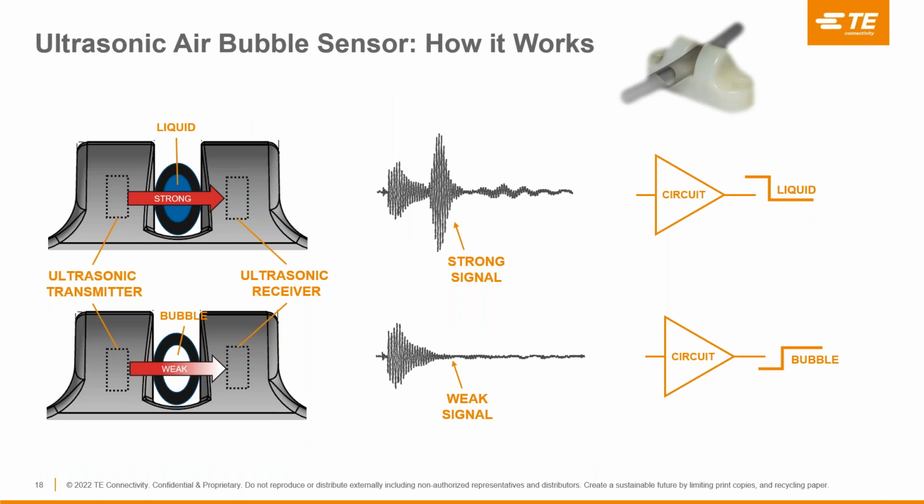Next, let's talk about ultrasonic bubble sensors. The TE air bubble sensors are integrated with electronics. The piezo crystals are mounted between the two posts in the housing that you can see in the picture here. One is the transmitter and the other is the receiver.